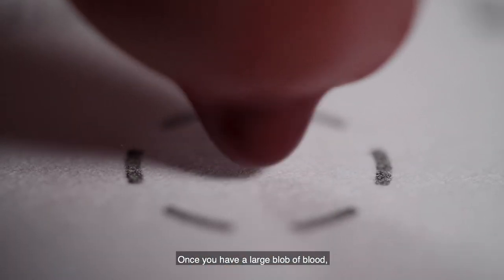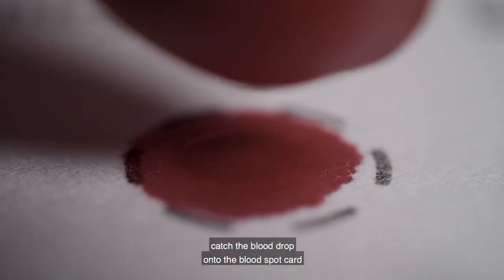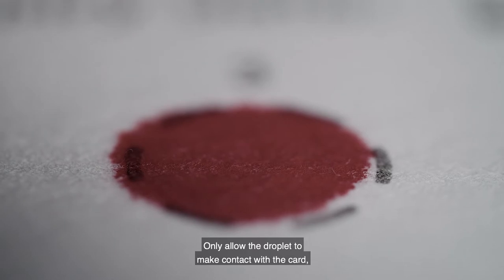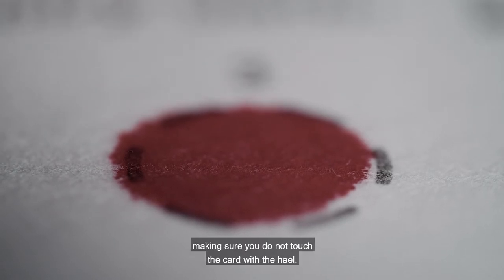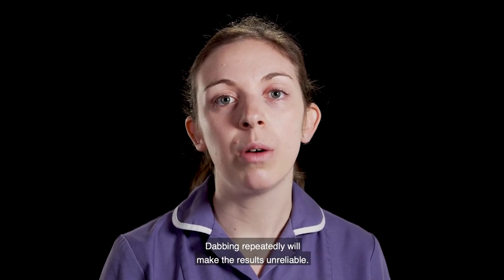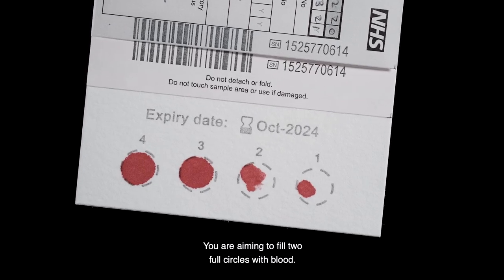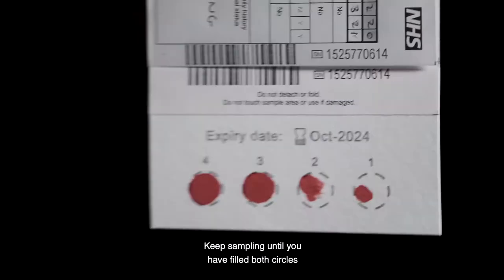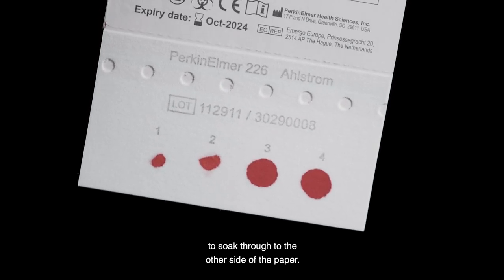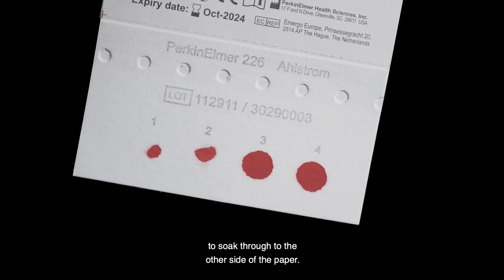Once you have a large blob of blood, catch the blood drop onto the blood spot card by aiming in the centre of one of the circles. Only allow the droplet to make contact with the card, making sure you do not touch the card with the heel. Only use one drop per circle — dabbing repeatedly will make the results unreliable. You are aiming to fill two full circles with blood, keeping sampling until you have filled both circles with enough blood to soak through to the other side of the paper.